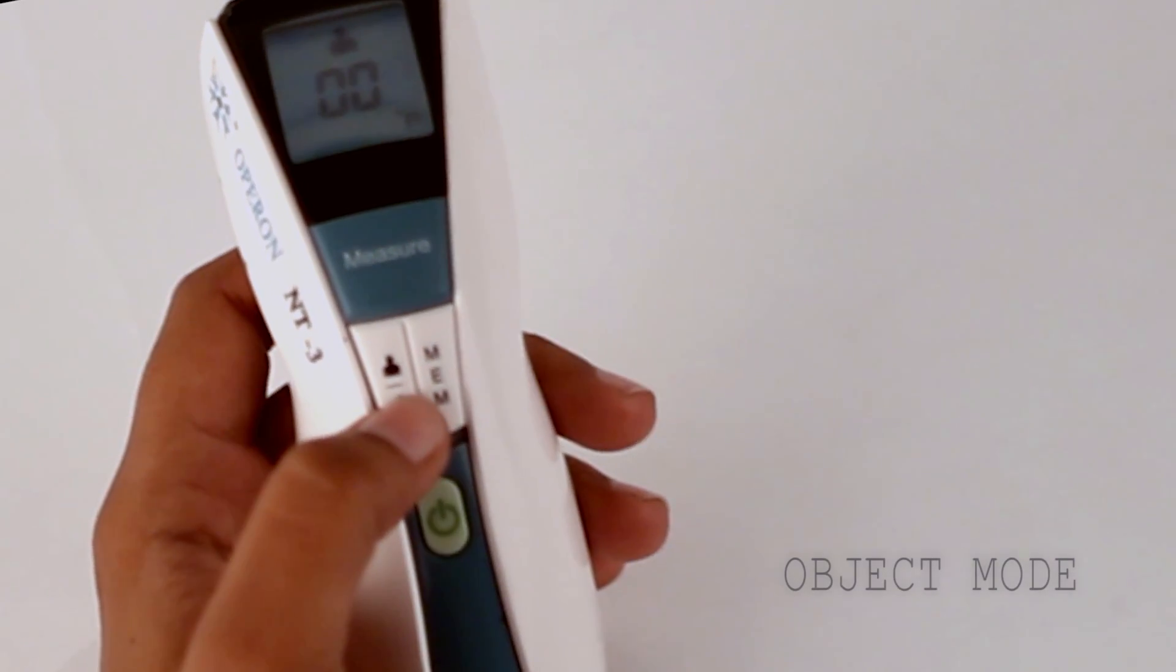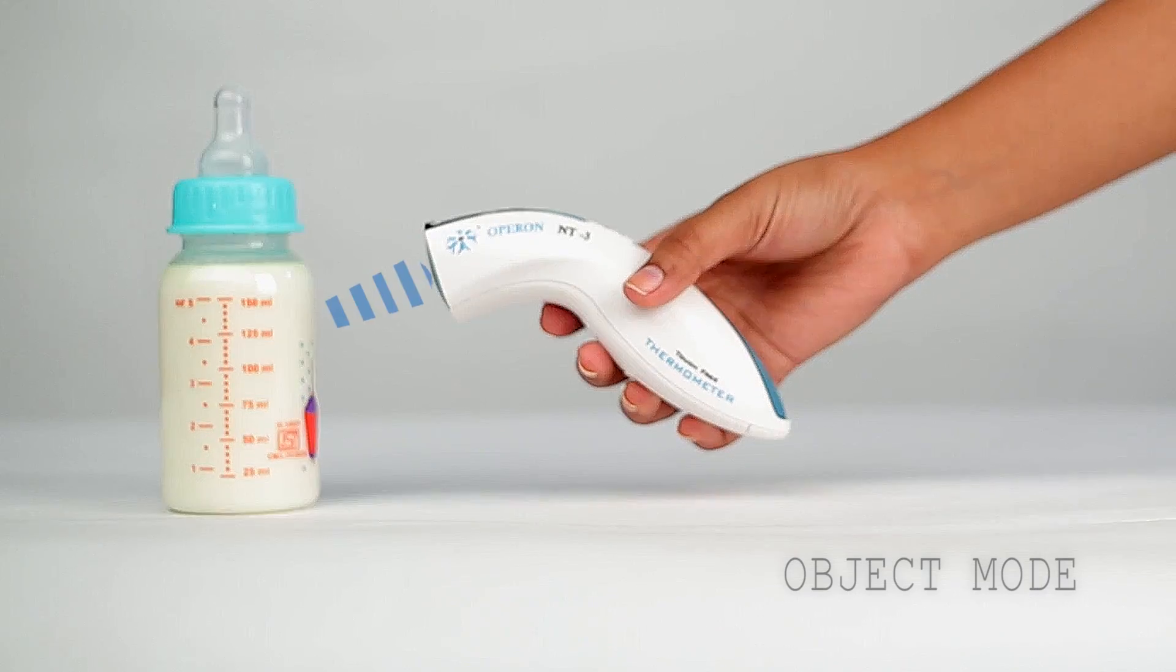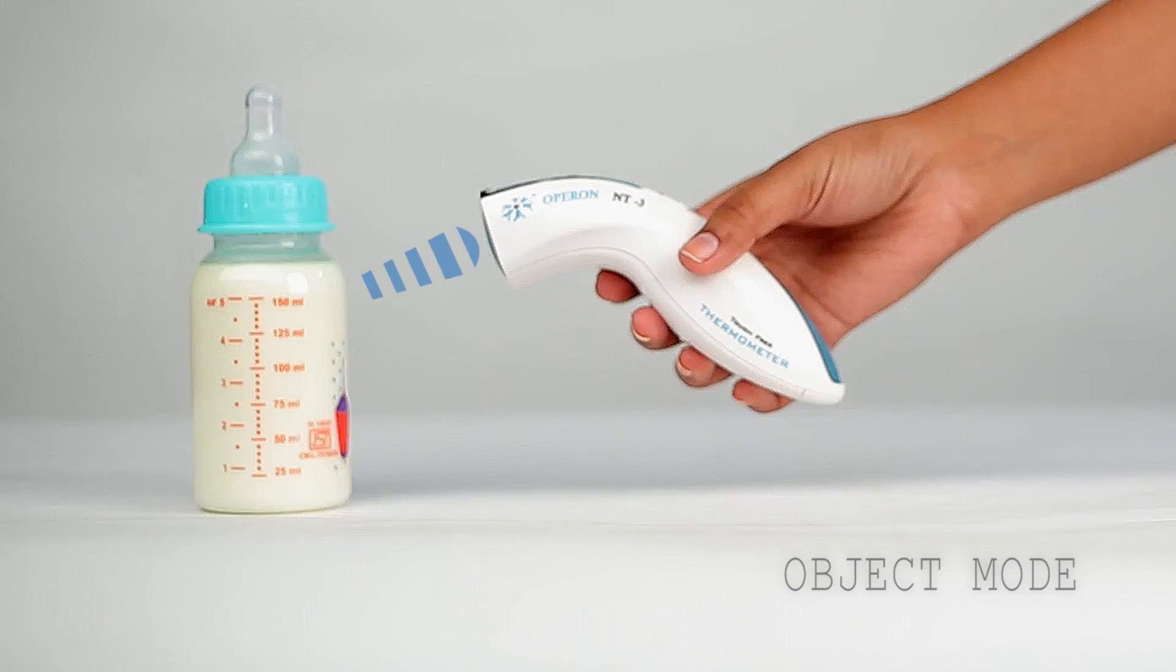For object measurement, select the object function and follow the rest of the procedures as described for human body. Object mode will not give continuous beep sound but only one beep.